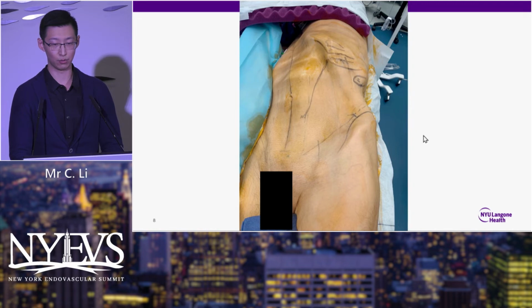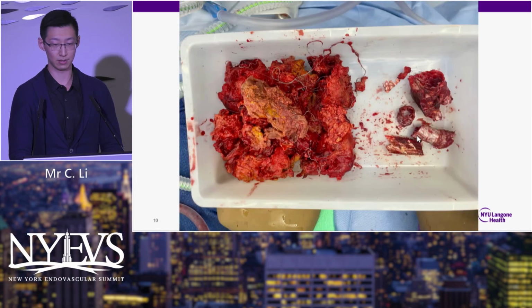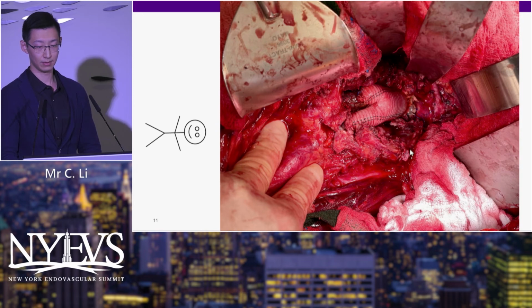And this is his position. We made our incision from the 9th intercostal space, partially removed the 10th rib, and extended the incision to the semilunar line. And we hugged the retrorenal space. And this is the material that we scooped out after entering the sac. As you can see, there are multiple coils and thrombus burden. We didn't really see overt purulence or signs of infection. And you can see the partially removed stent graft, what used to be the Gore Excluder, and partially removed limbs. And this is a picture of the reconstruction.